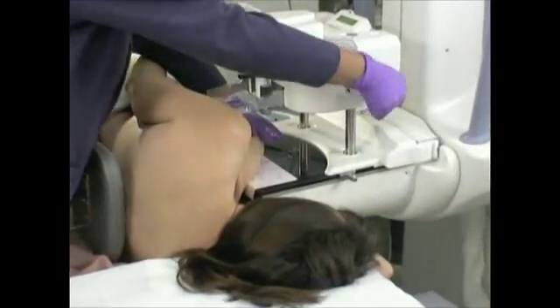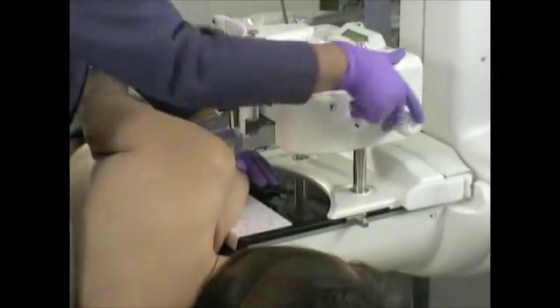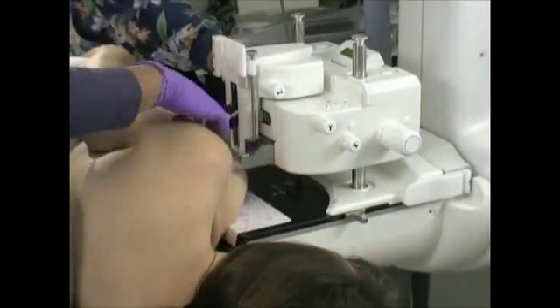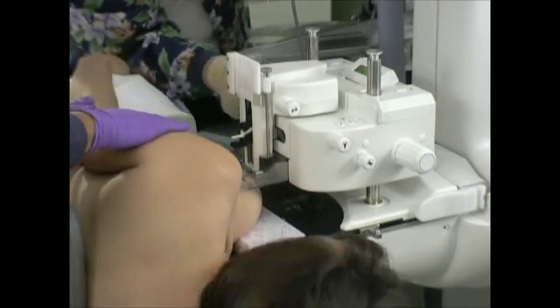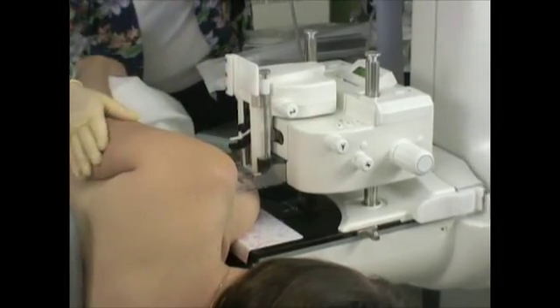We've reviewed the prebiopsy mammogram and have an idea of where in the breast the calcifications are located for our preliminary targeting pictures. Sometimes it's useful to do a prebiopsy mammogram and to place a BB marker on the skin prior to bringing the patient into the stereotactic room, as that can help with localization.